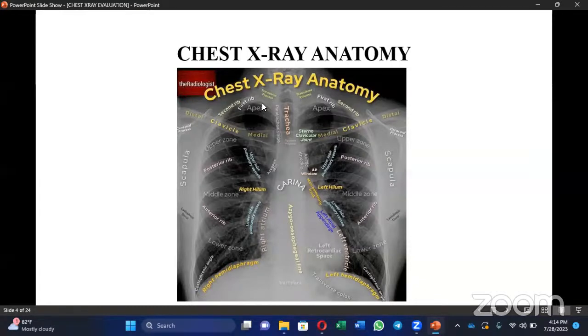And then within the lung region, we have the ribs. Okay, the places where my cursor is, this one, that one, or this, they are all ribs. On a chest X-ray image, it is very important to be able to differentiate between the two sets of ribs. We have the anterior ribs and the posterior ribs. It is very important to know the appearance of the anterior and posterior ribs.